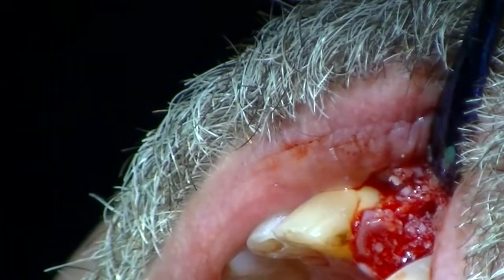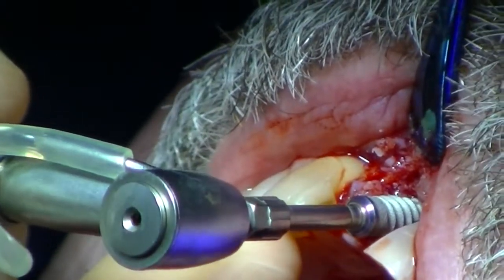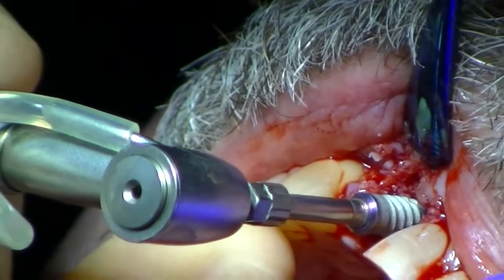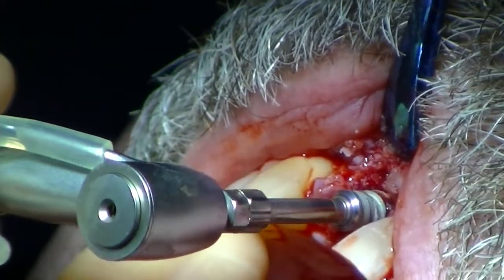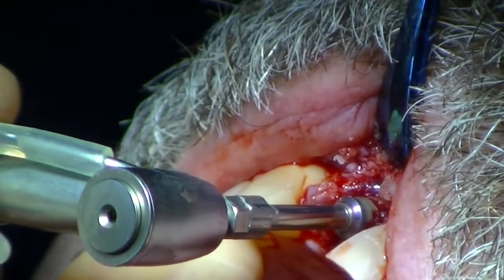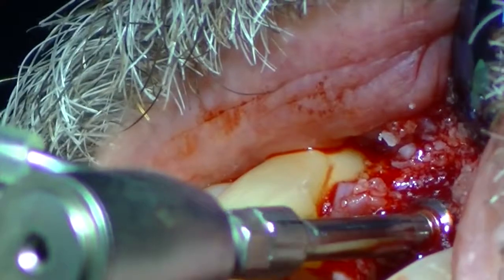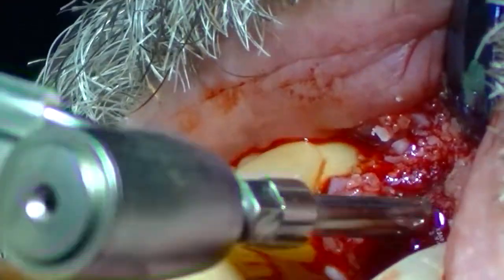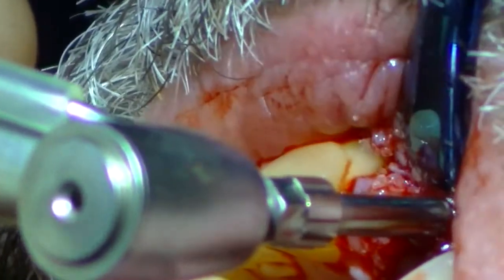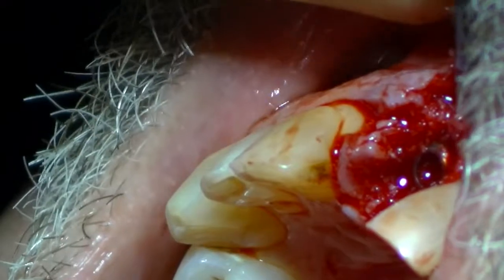And we'll go to our implant motor. You can see very slow, engaging. I can actually see it because I reflected it. Okay. Position of that implant.